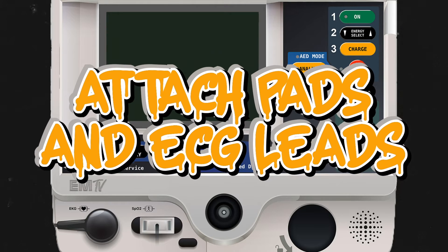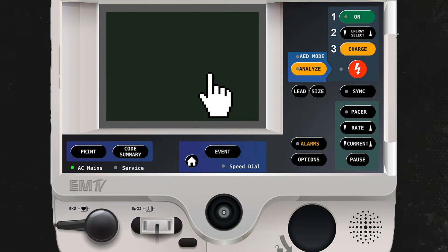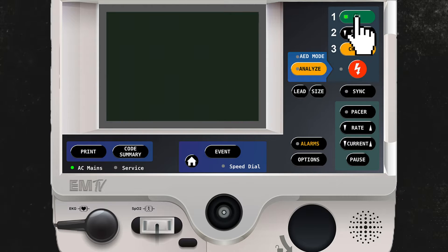Before we get started, it should be noted that this patient must have both the defibrillator pads as well as the included 3-lead ECG cable attached. Go ahead and turn on your monitor.